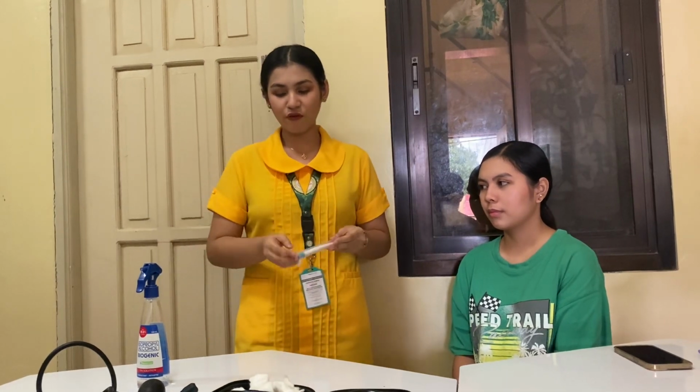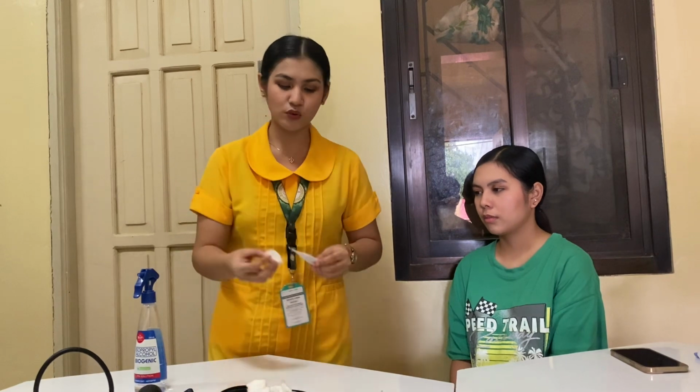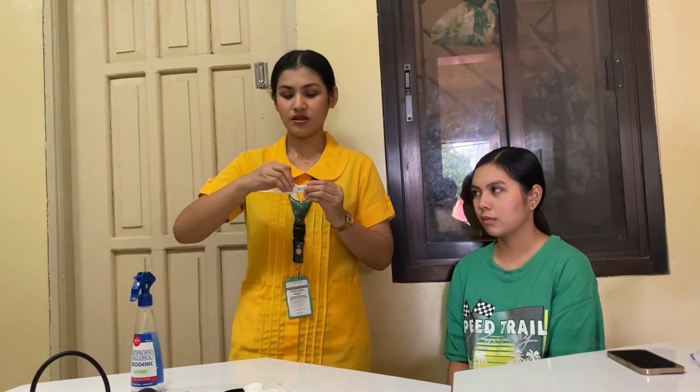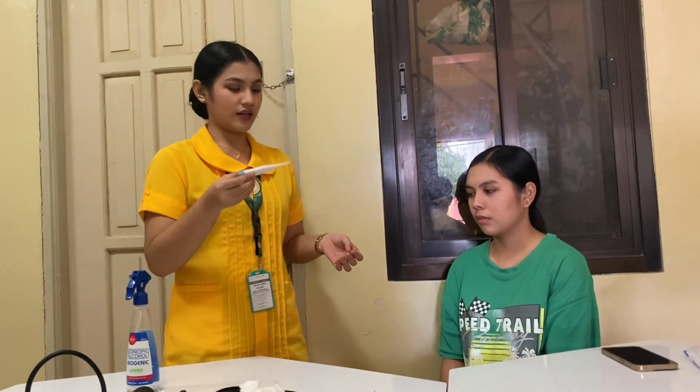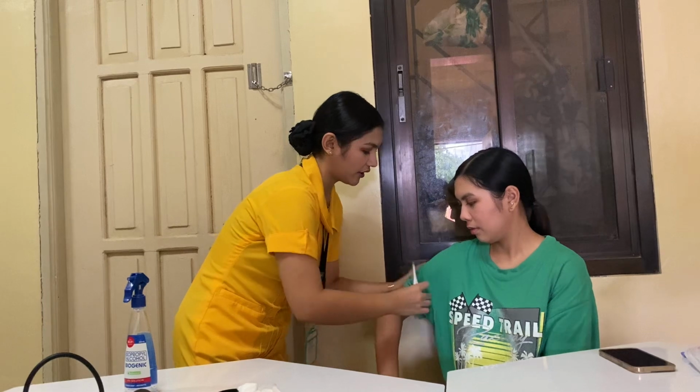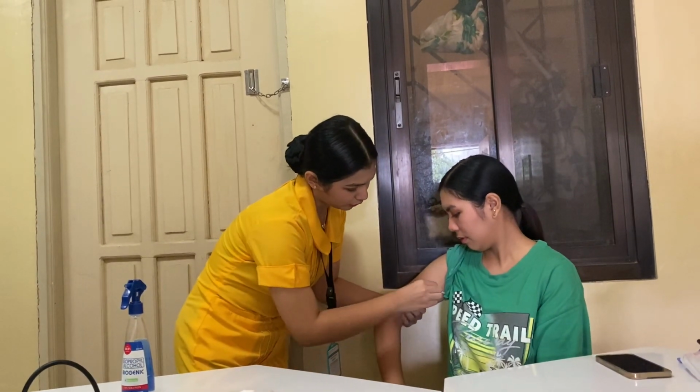So now we're going to clean the thermometer. Before use, we have to clean it from bulb to stem, from cleanest to dirtiest. And then dispose of this. And then we're going to turn it on and put it on the client's armpit and wait for the thermometer to beep.